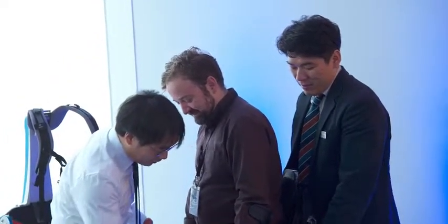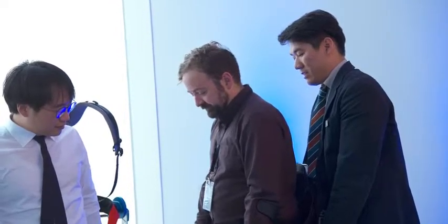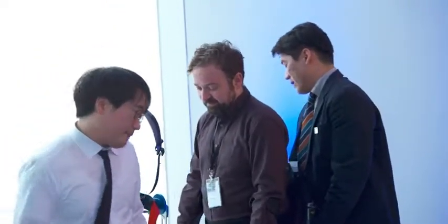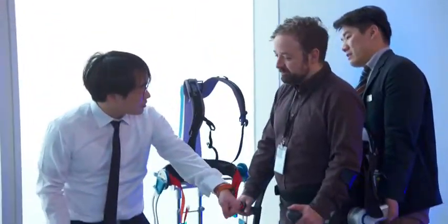You can move your leg right now — just standing together like this. Just standing. You are a paraplegic, so you don't know how to use the crutch, right? There is a special thing for paraplegics using a crutch in a triangle shape.